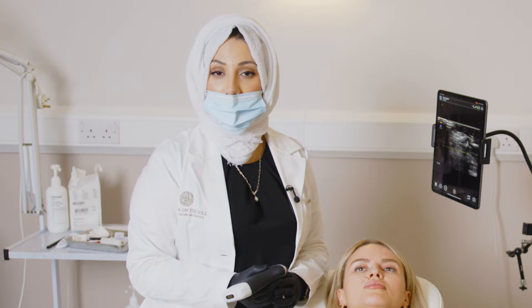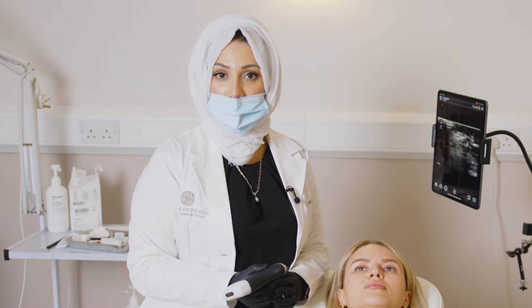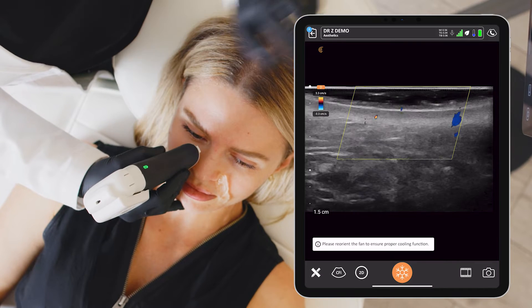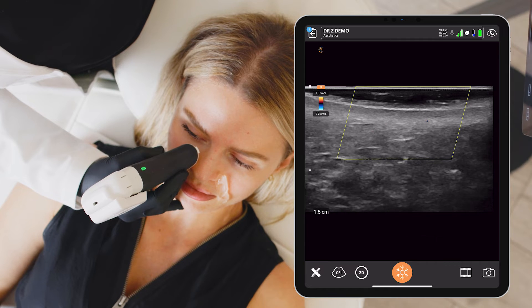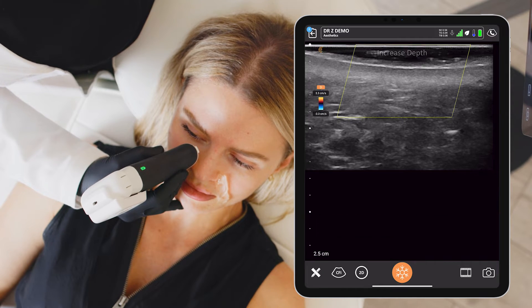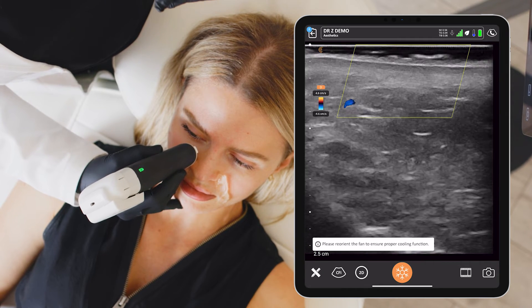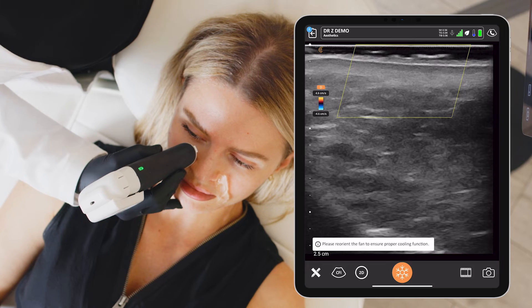However, we need to make sure that there is no vessel sitting right there. Increased depth — good, so here we need more depth. Lovely.